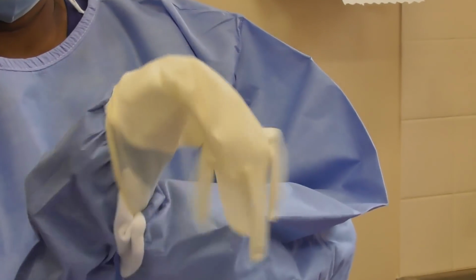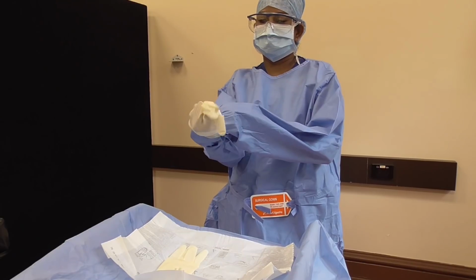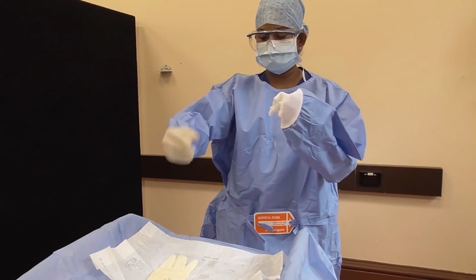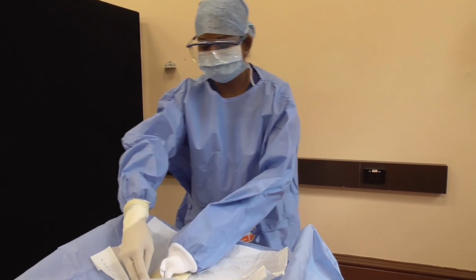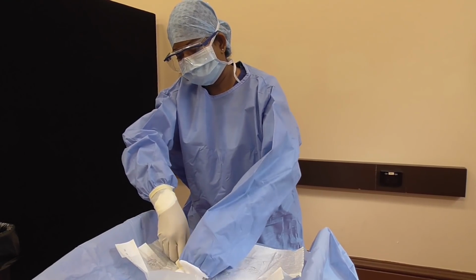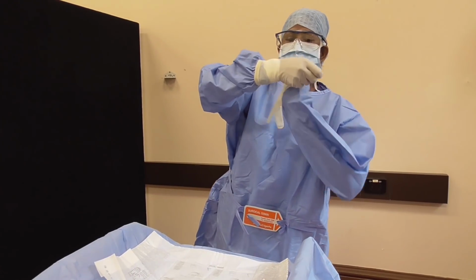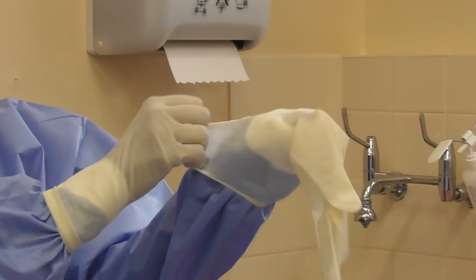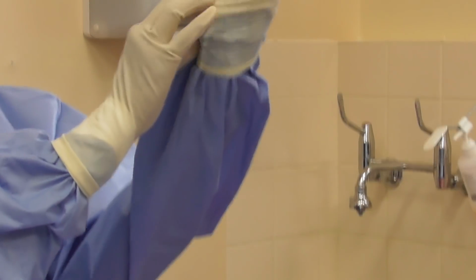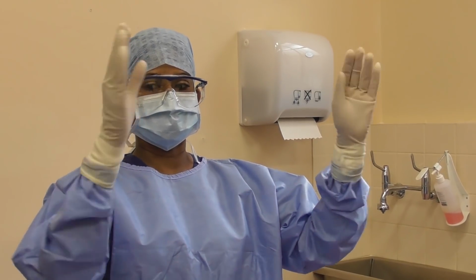The white cuffs of the gown should not come out from under the gloves, so ensure you pull the gloves down as far as possible before pushing your fingers through. Using your non-dominant hand, grab the folded cuff of the glove and repeat the same process. As your other hand is sterile, you are able to touch the glove to assist you in getting the second glove on. Make sure that the cuffs are tucked under the gloves. In theatre, you will don a second pair of gloves for further protection.